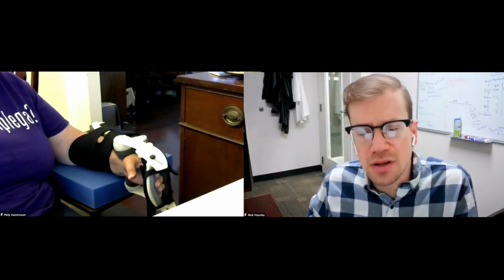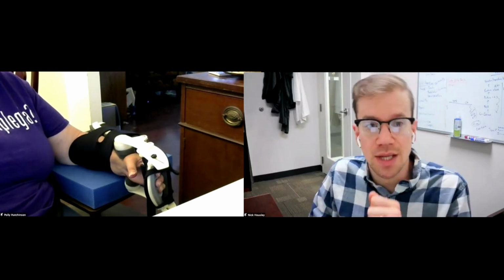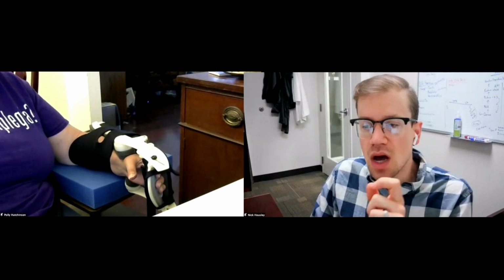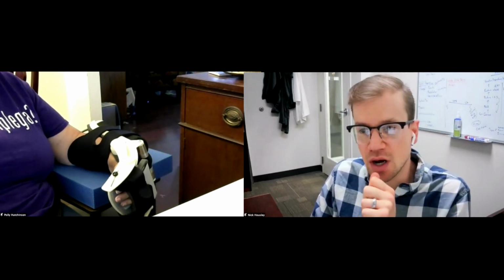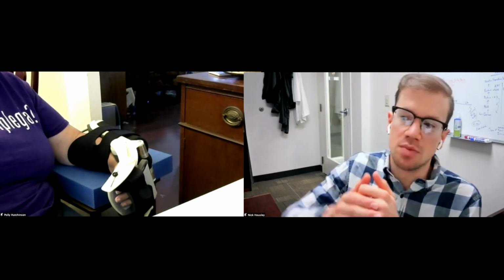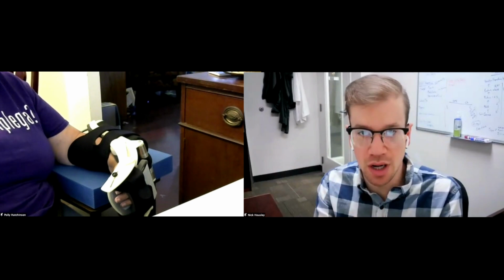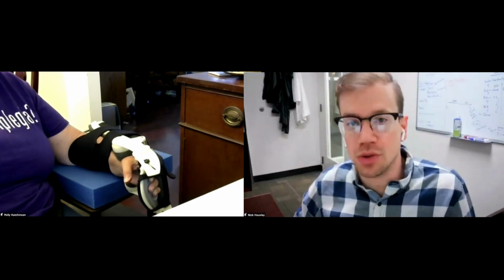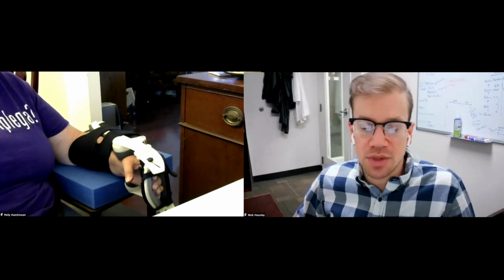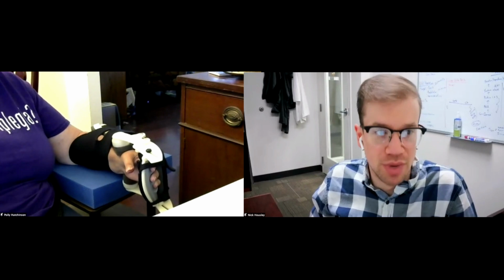The other thing that I like about that approach is that even though you have the power off button hit, the data can still be transmitted. If you find that there might be some communication issue, and there is local storage of data on your console that needs to hit the server so it can be analyzed, that will also allow it to happen. So generally speaking, leave it on in terms of just general best practices.